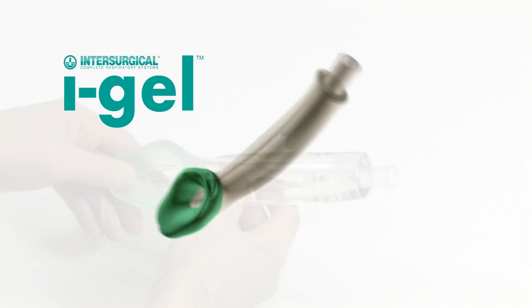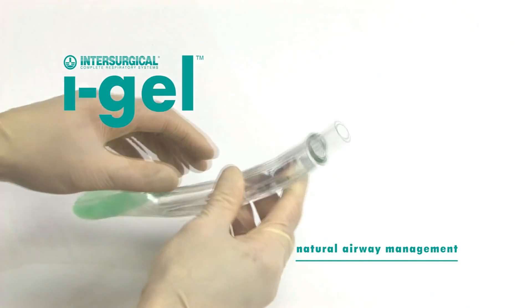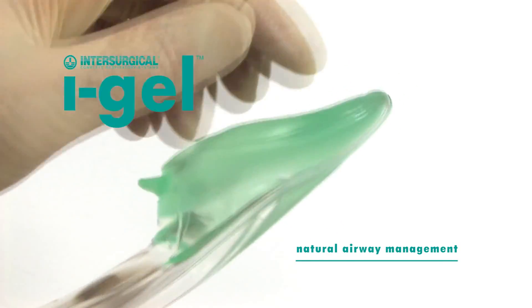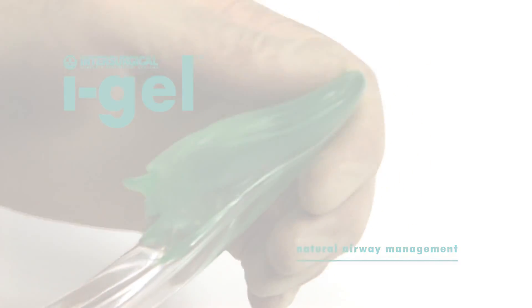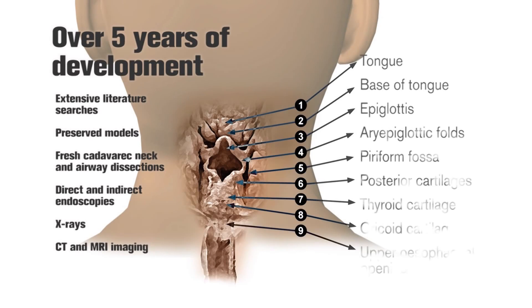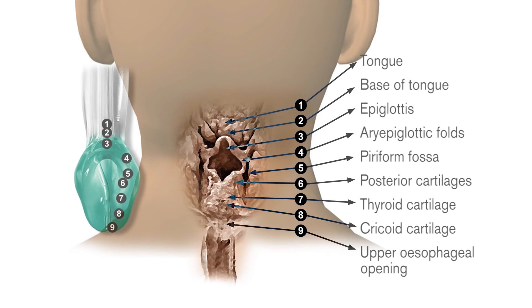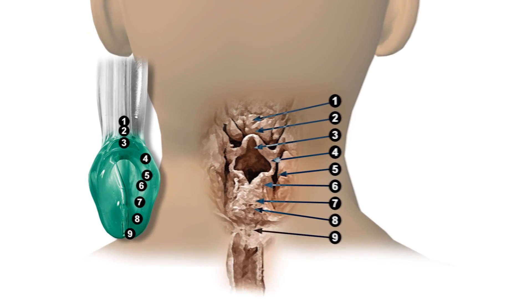The iGel is a novel and innovative supraglottic airway management device made of a medical grade thermoplastic elastomer which is soft, gel-like and transparent. It took over five years of development to perfect a non-inflatable anatomical seal of the pharyngeal, laryngeal and perilaryngeal structures that would reduce compression trauma.